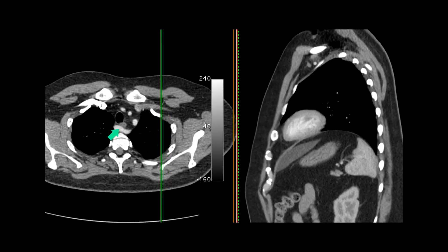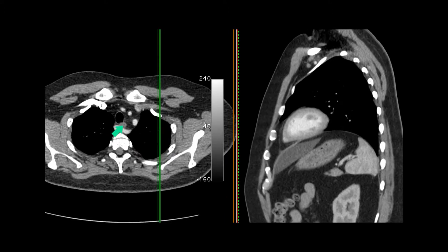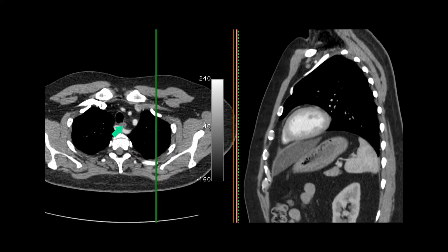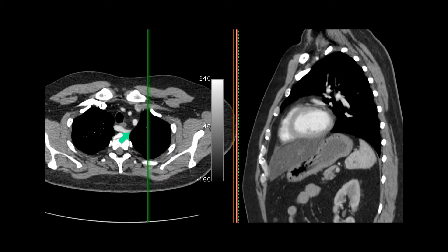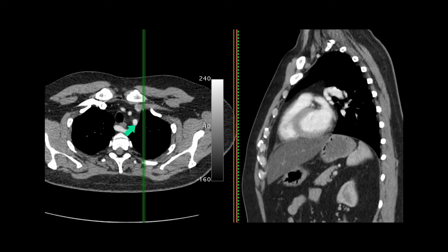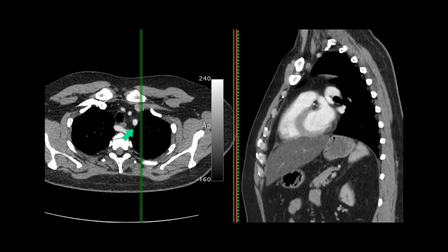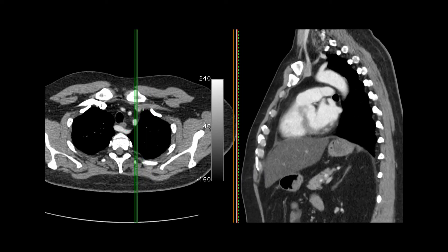In this video I'll be discussing the common normal variants in the chest. The first one is the aberrant right subclavian artery. You can see that there is an artery behind the esophagus, arising distal to the left subclavian artery from the aortic arch.